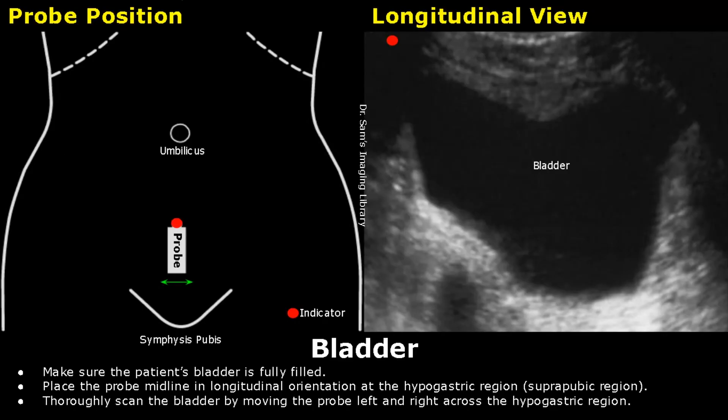Hello everyone, this is Dr. Sam and this video is about bladder ultrasound probe positioning. On the left side is a schematic diagram showing ultrasound probe positioning.